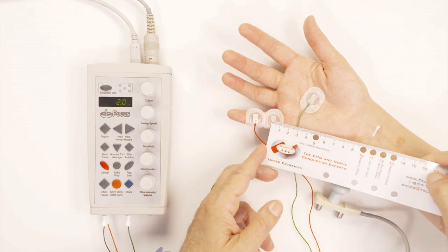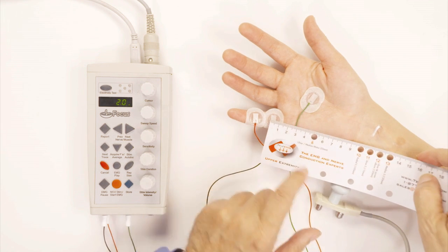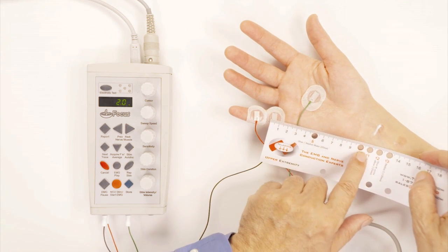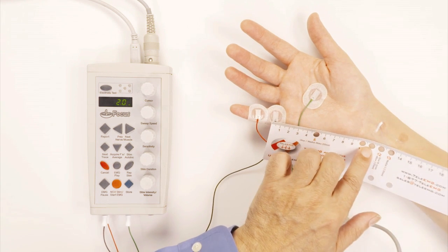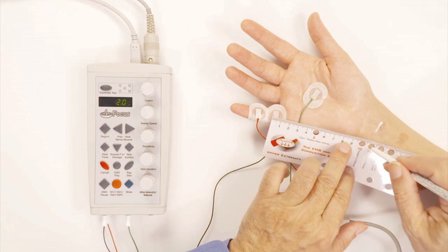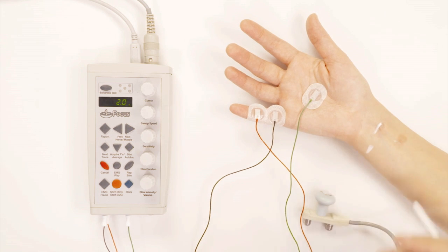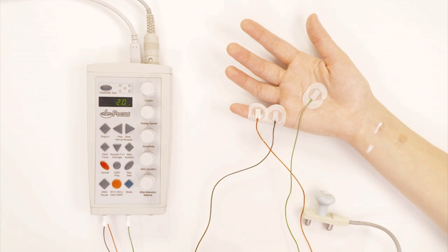Now I need to measure for the ulnar sensory as well. I put the ruler right here, and I see that where it says 11, that's where the ulnar sensory measure is. So again, the same thing—I use the marker to mark the place where I'm going to stimulate the ulnar sensory, again at the wrist like I did for the median sensory.